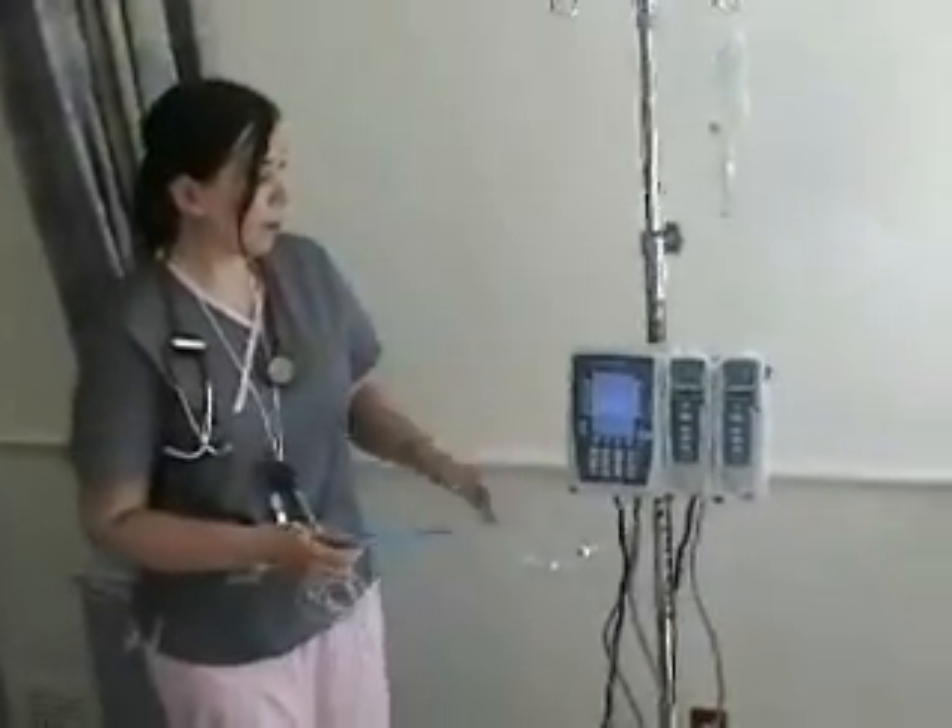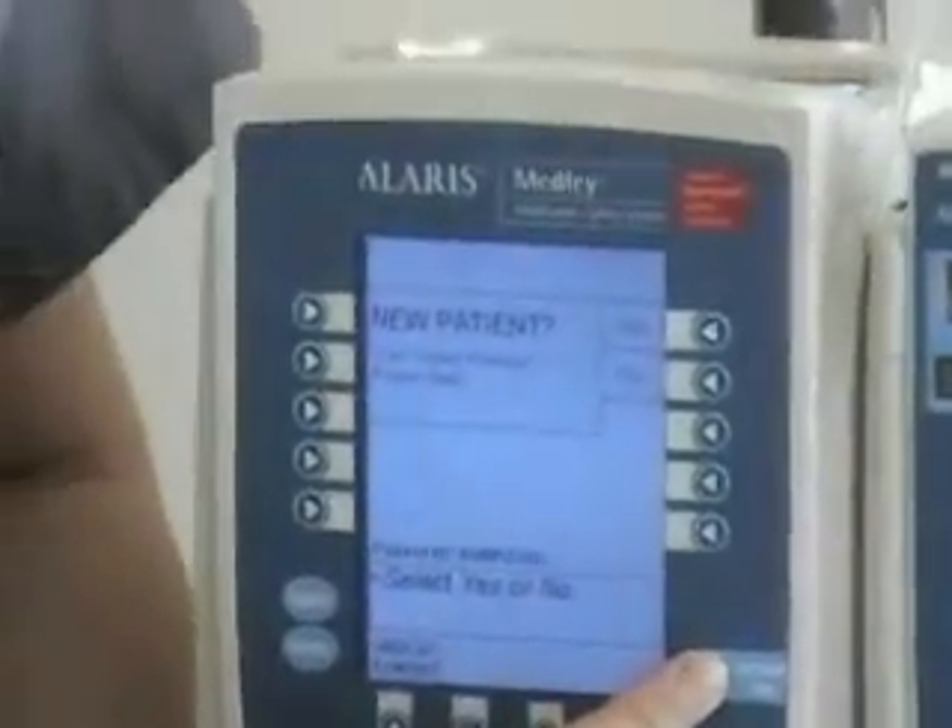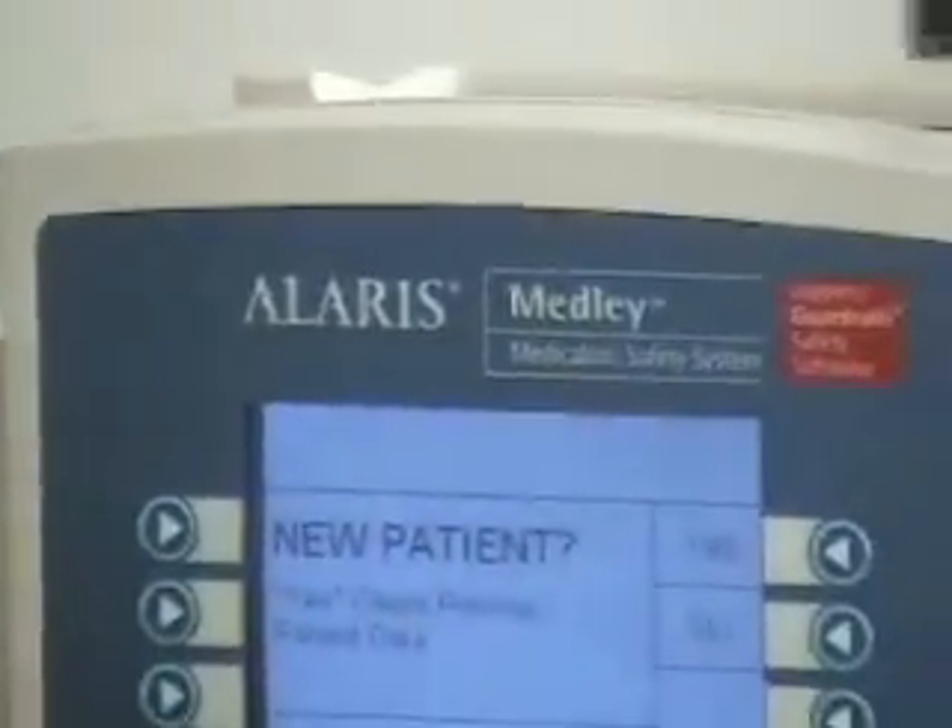Hello, students. I'm going to show you how to use the Alaris IV pump. We've already powered it on by pressing the systems on button right here and holding that down for a few seconds, because it takes a while to turn on.